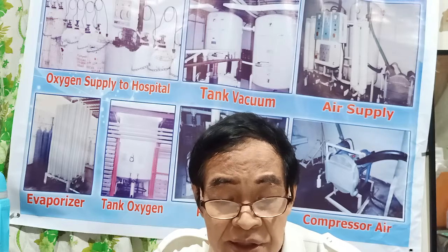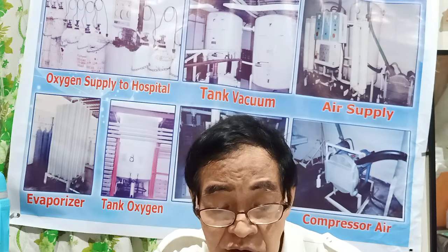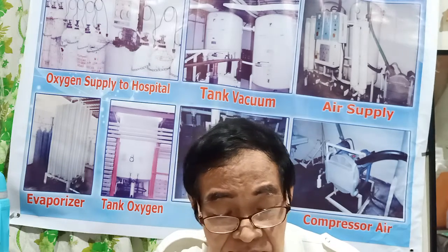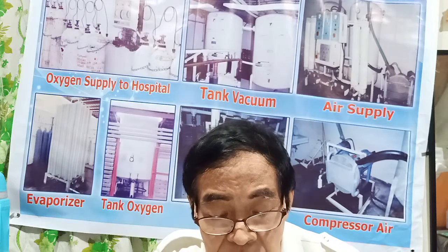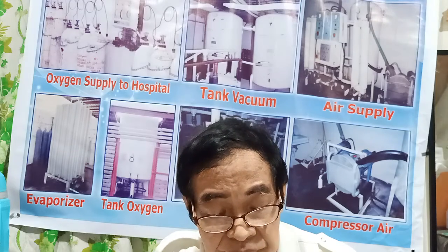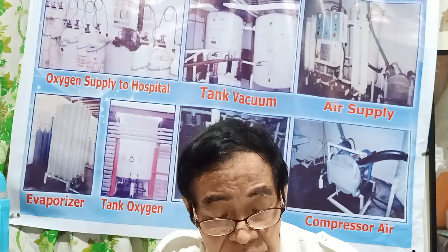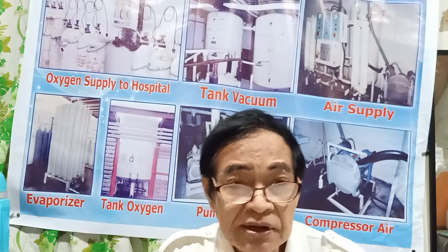They are selected materials for use at temperatures as low as minus 196 degrees centigrade. That is important, the correct materials installation for the pipe. And also, dry ice plug. Okay.